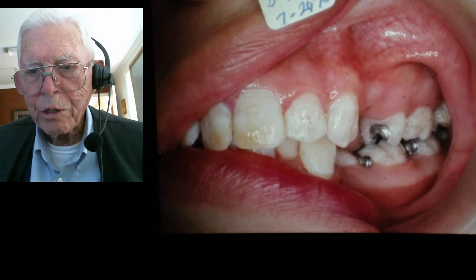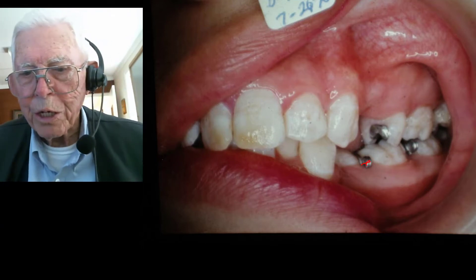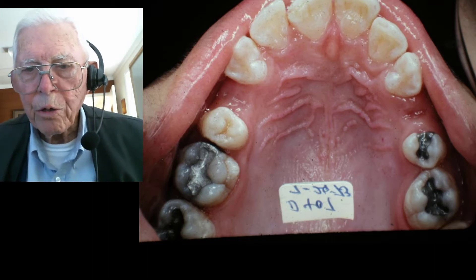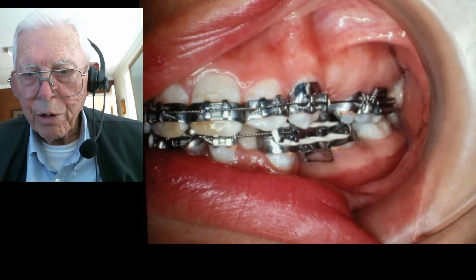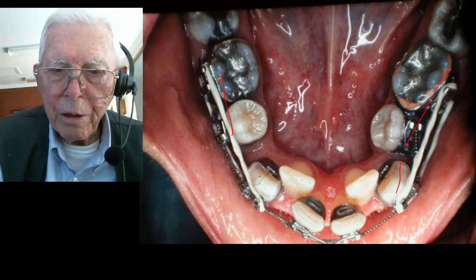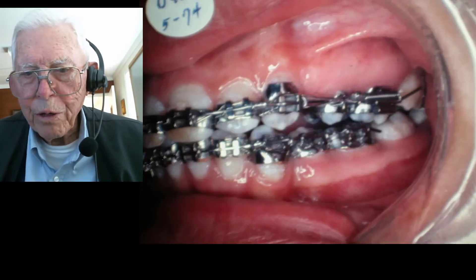For regular orthodontics, I'm going to cover it pretty quick. We use these little spring separators here — you just pry that loose and slip it between the teeth. They're very good. Now we're going to close this space up and bring the teeth together in the regular orthodontics. We're closing those cuspids and lining up those lower anteriors, bringing the cuspids back, getting room, and here we're just about finished with the regular part of the dental work.